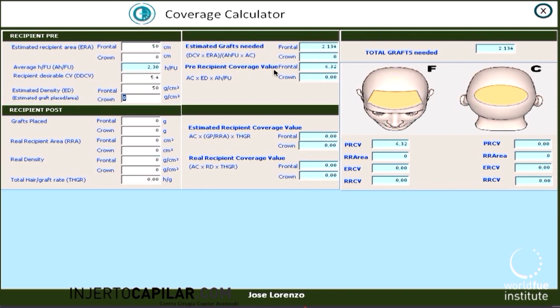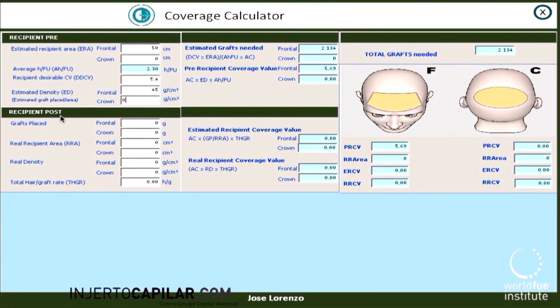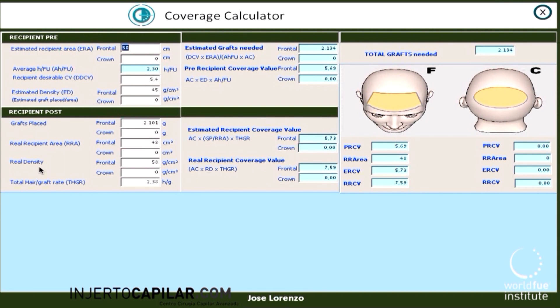You will always get an idea of the final coverage you will have at the end. In the last compartment, we need to distinguish the grafts placed in the frontal and/or crown areas, the total hair-to-graft rate extracted, and we measure the recipient areas again in order to be accurate. The real density is recorded after 24 hours when the patient comes in for washing the next day. With those data, we will have the estimated and real recipient coverage value — and again a summary picture.